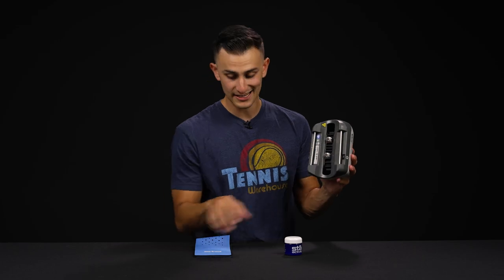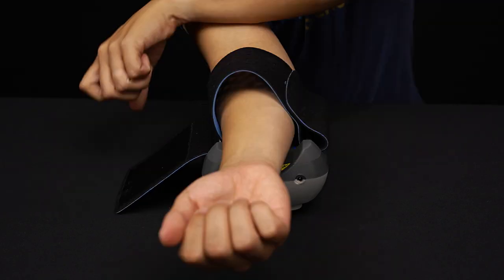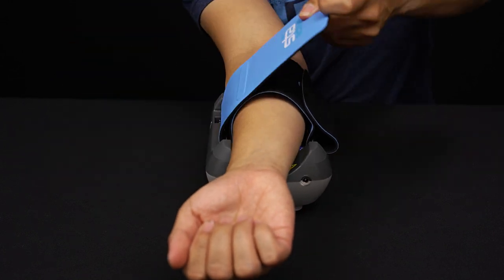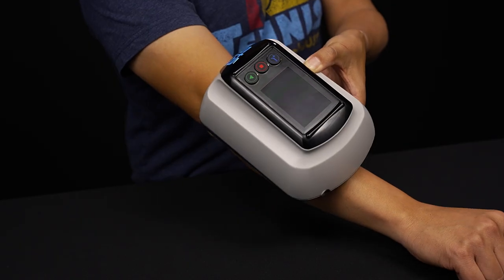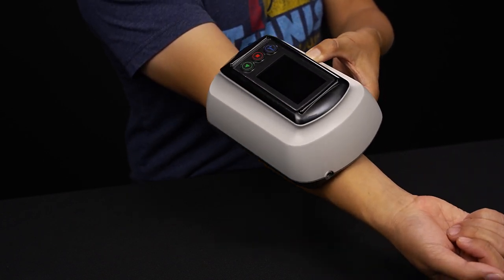Here is where you're going to take this strap right here — it's going to thread through, and all these tutorial videos are going to be found on the app. But once that strap is on, it's going to be placed on the top of the arm for tennis elbow, or if you're having golfer's elbow, underneath it's going to go here.